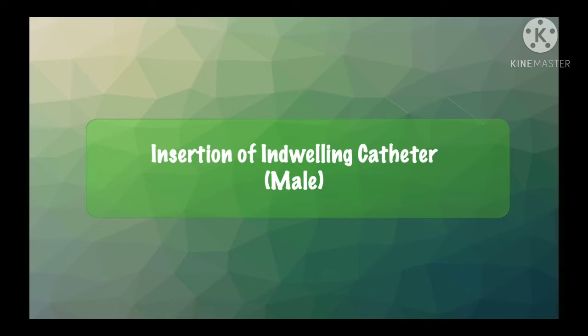So, insertion of indwelling catheter for male patients. For the assessment, assess the type of catheterization that is ordered by the doctor, if it is a straight catheter or an indwelling catheter.